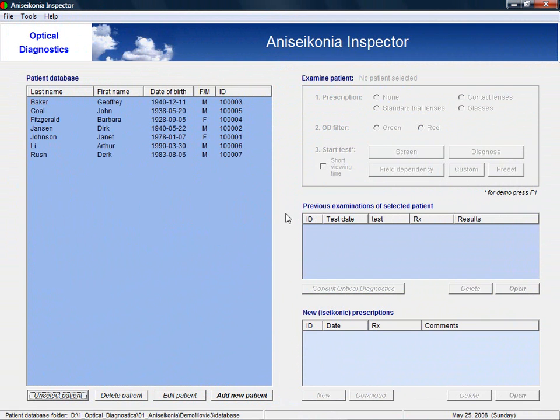Here you see the main window of the Aniseikonia Inspector. On the left you find the patient database. You can simply add a patient by clicking on the add new patient button.